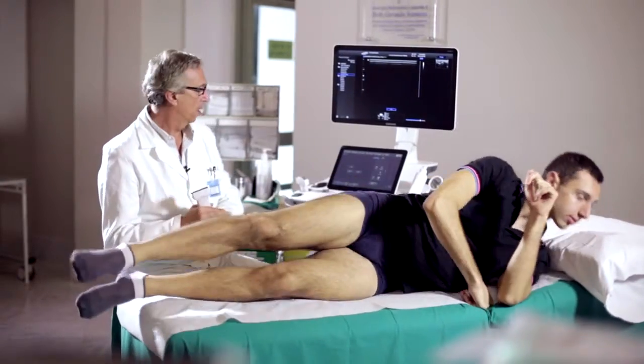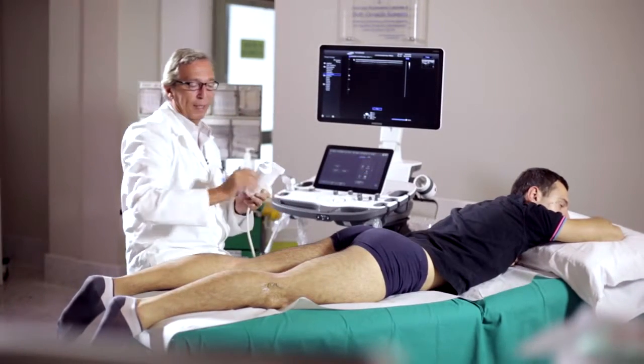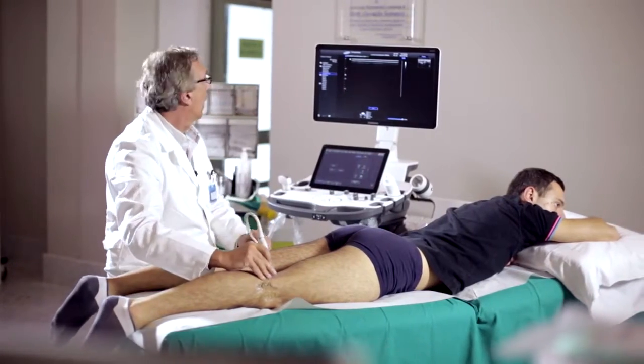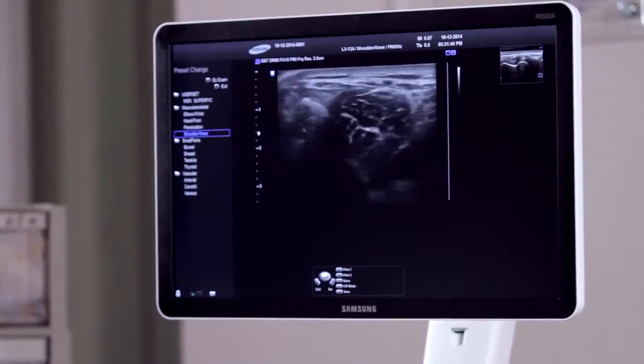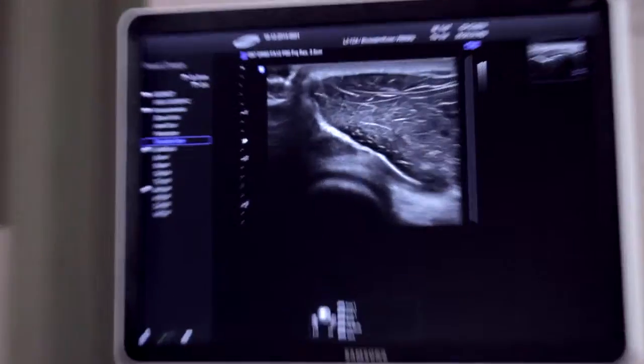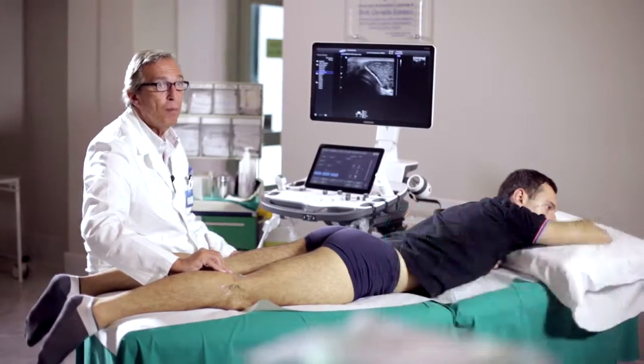Now we shall look at the last compartment, which is the posterior compartment of the knee. We will ask the patient to lie on his stomach in order to be able to scan this area. We will initially use axial scans. In this medial posterior region, we recognize the components of the gastrocnemius muscle and the semimembranosus muscle, which are contiguous and, as we know, are separated by the common bursa of the gastrocnemius-semimembranosus. This bursa, in this case, is not visible as it is collapsed and not filled with liquid.